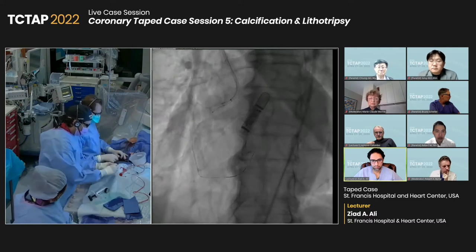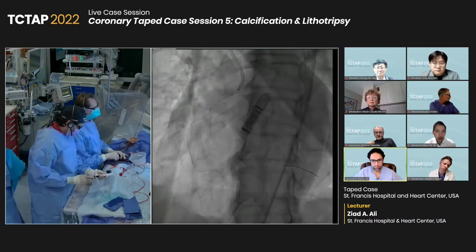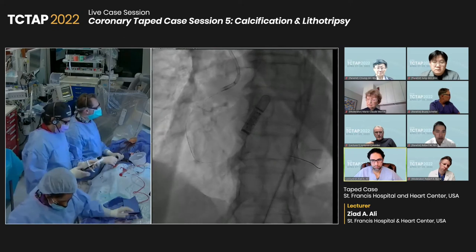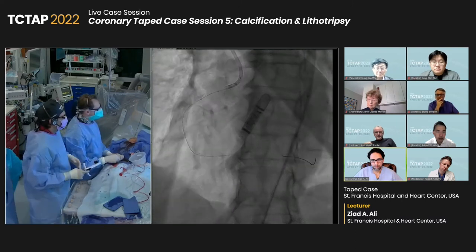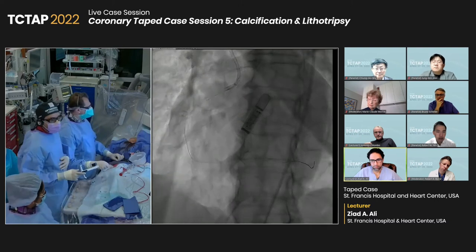Let me rewrap this. You have a new three, five, or three. What do you have in the room, balloon-wise? NC? Okay. All right, let's rewrap it and see if it goes. I'm just going to rewrap this. We'll just wait for 1 second, Casey. No. Okay, we'll take that new balloon. It just doesn't enter the lesion. Wow. Yeah. 3.5 is great.